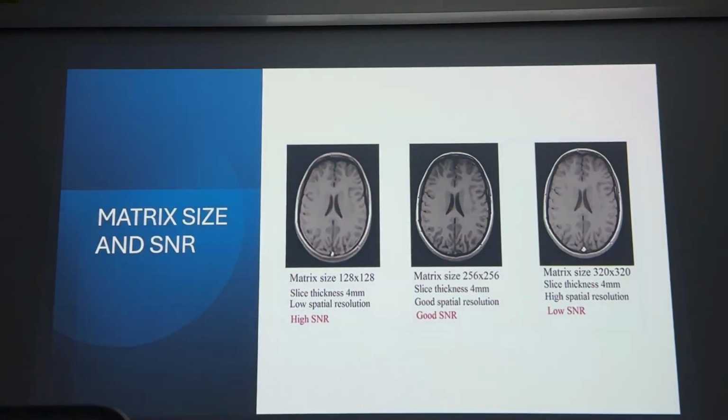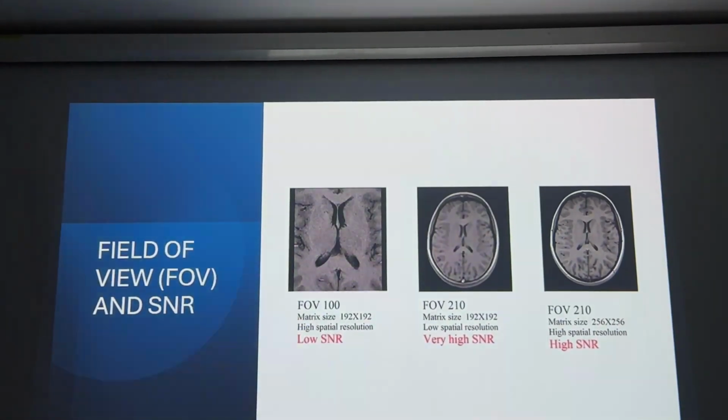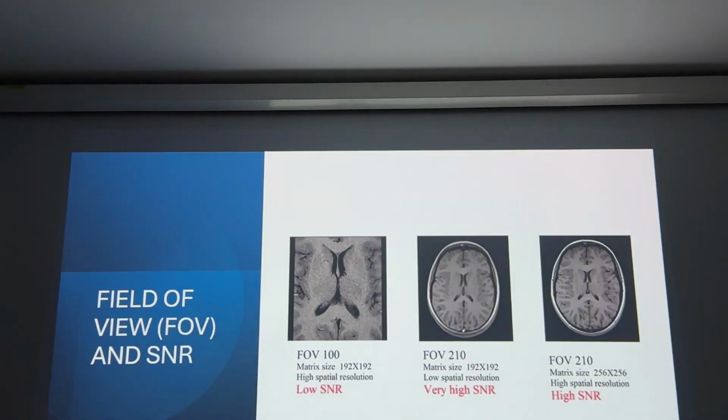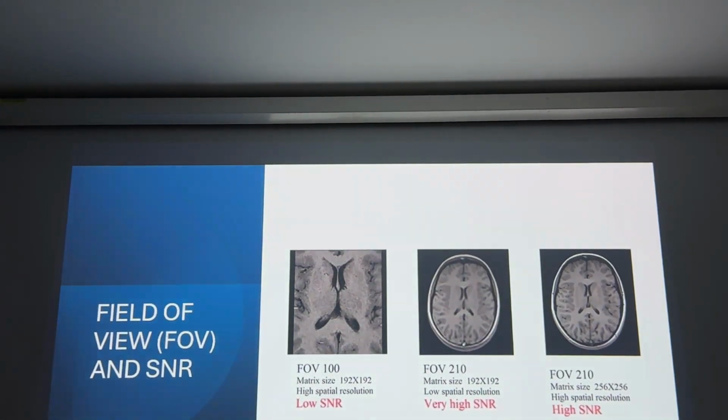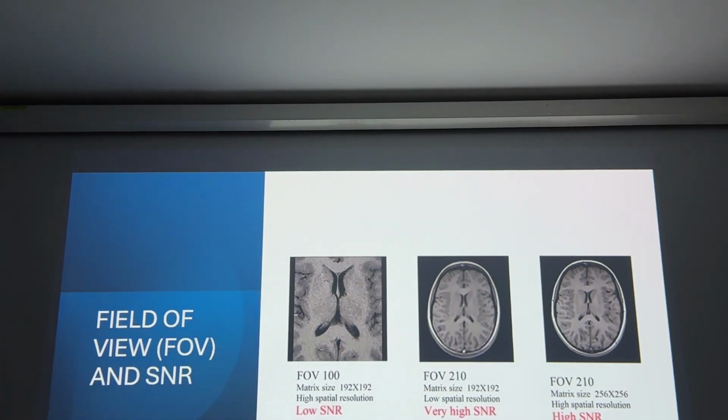Field of view and SNR. Increasing the field of view leads to increased SNR. Why? Because of increasing pixel size and amplifying the signal captured by individual pixels.